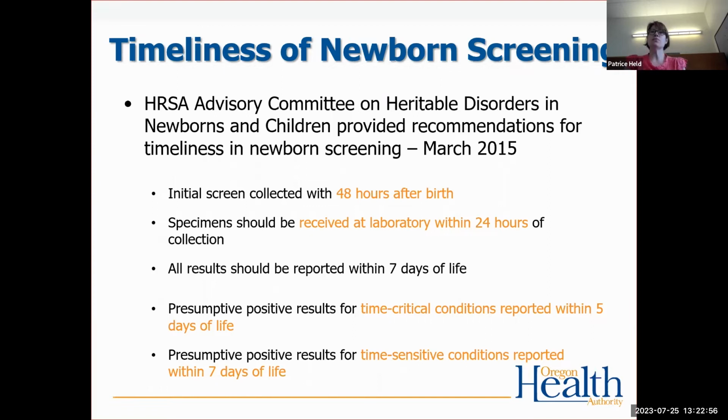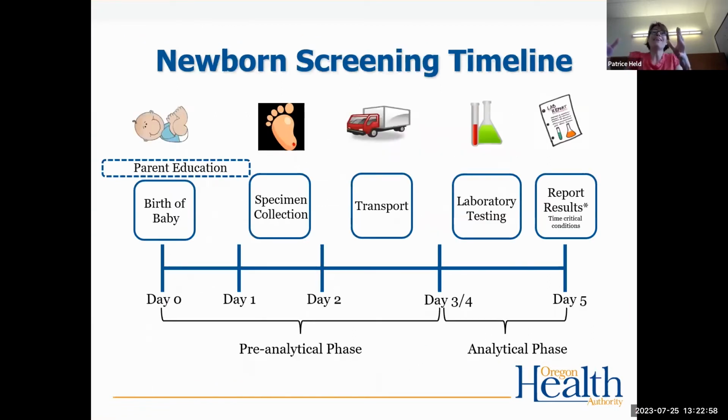And so using these recommendations, we now have a really condensed timeline where birth of the baby is happening on day 0. Specimens need to be collected between day 1 and day 2, transport to the laboratory within a single day, ideally, laboratory testing done on day 4, with results reported by day 5.